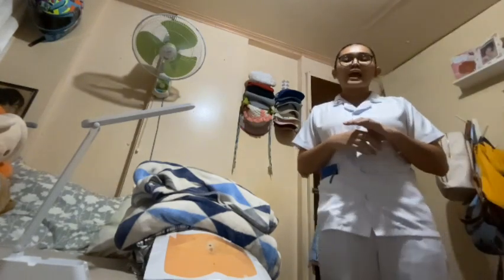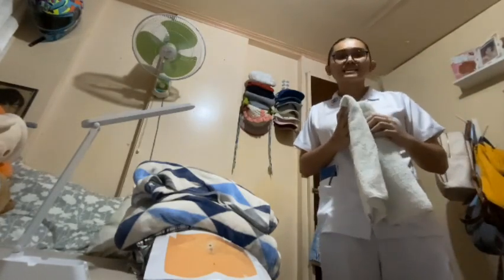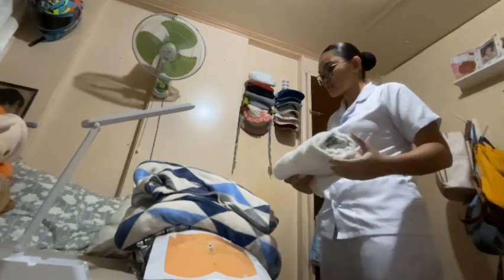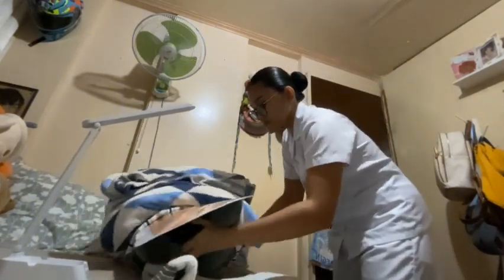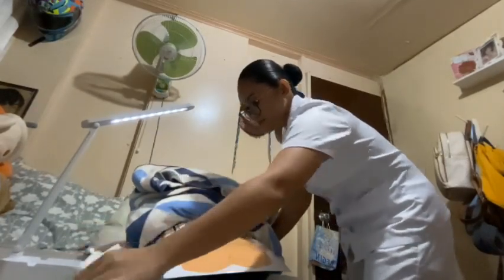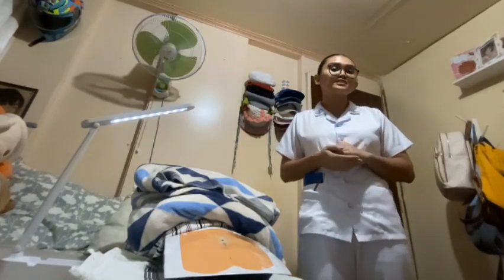Now, after arranging, I will place a waterproof drape under the patient's buttocks without contaminating the center so that the bed is protected from being soiled while the sterile field is preserved. Okay, ma'am, I want you to turn gently to your side po, so I can place this protective sheet under you. Okay, thank you. Now I'm going to apply sterile gloves while observing sterile technique because this prevents microorganisms from entering the urinary tract.